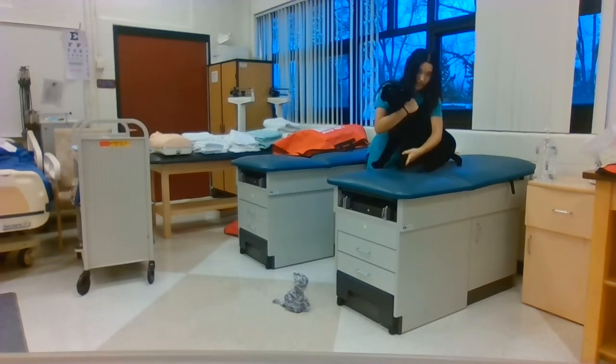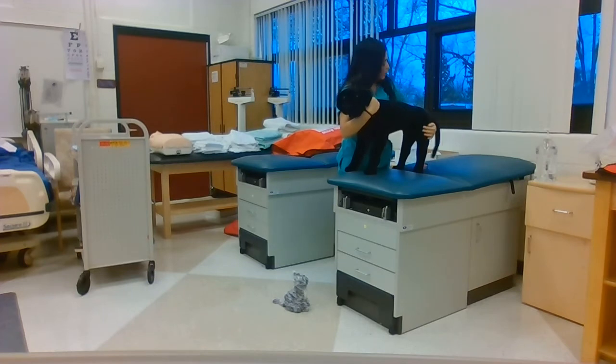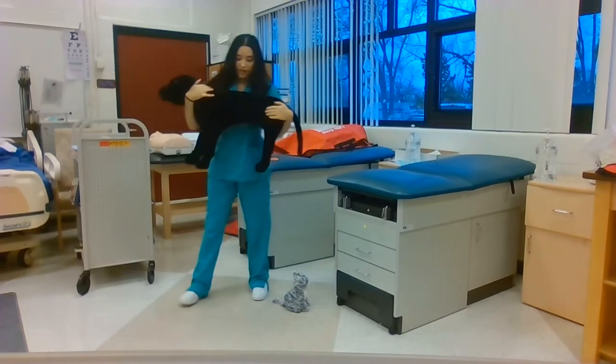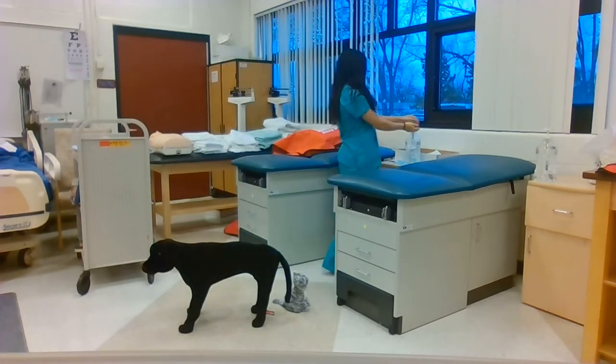The blood has now been drawn. Get the dog back into the sitting position, putting your leg back around the rear of the dog and keeping the hand just below the neck, lifting the dog back to the ground using my legs and not my back. Now I'm going to use alcohol-based hand rub again to maintain hand hygiene.